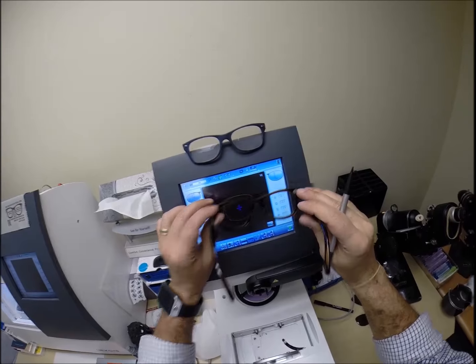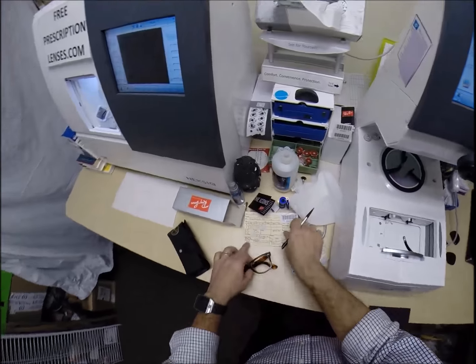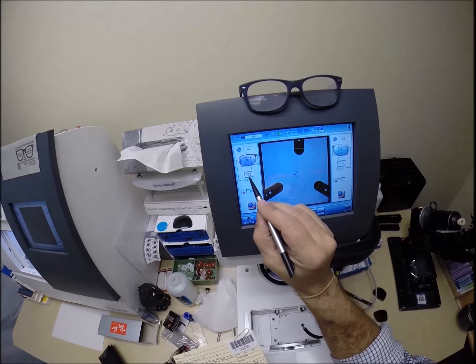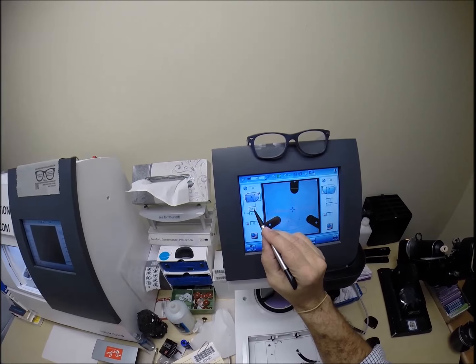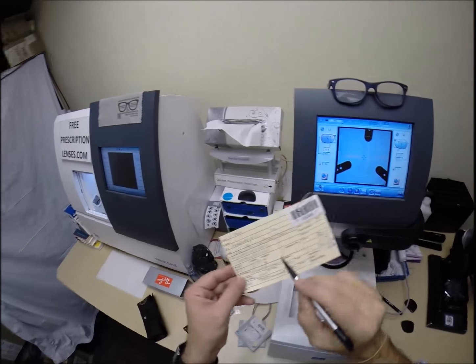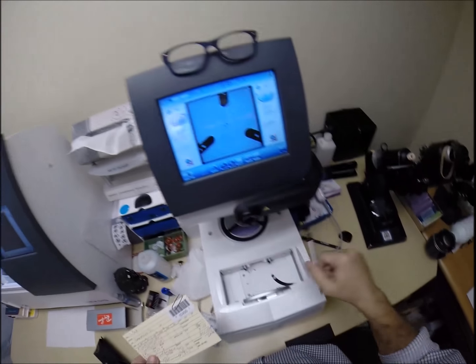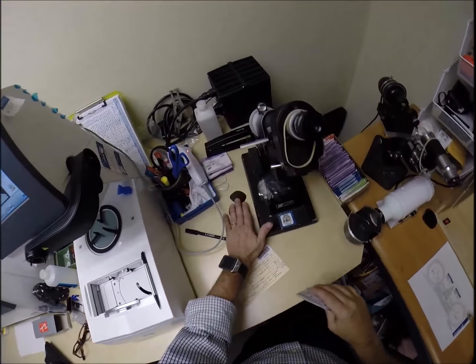So that's the shape that we'll be cutting. I'm going to move that onto the next screen. Your pupillary distance is 63, so divided by 2 is 31.5. The computer starts at 32.5, so I'm going to tap the minus button twice till we get down to 31.5. I'm going to raise the optical center height up to 23. There we go. Now we just have to get your lenses prepped. Move that out of the way.